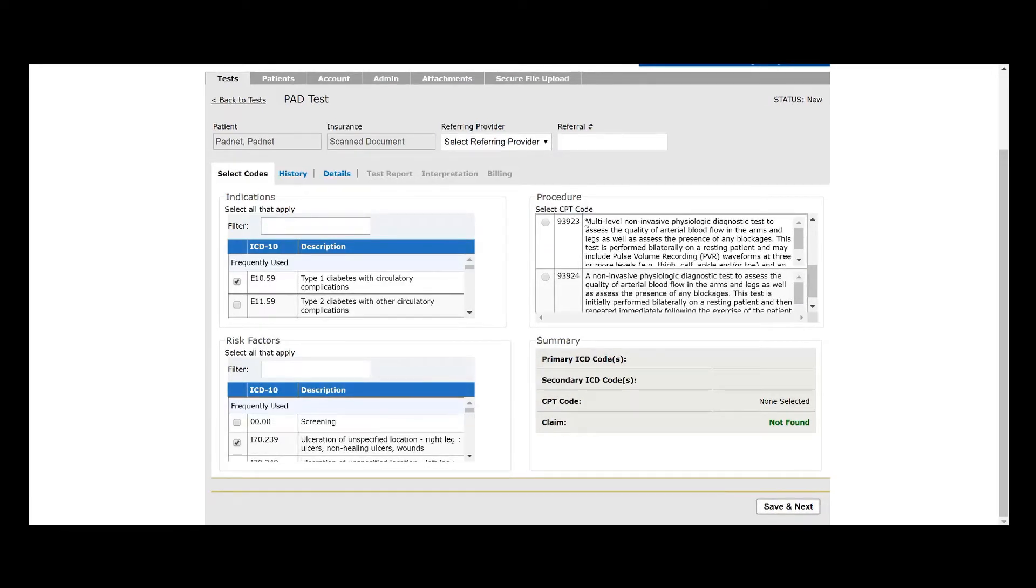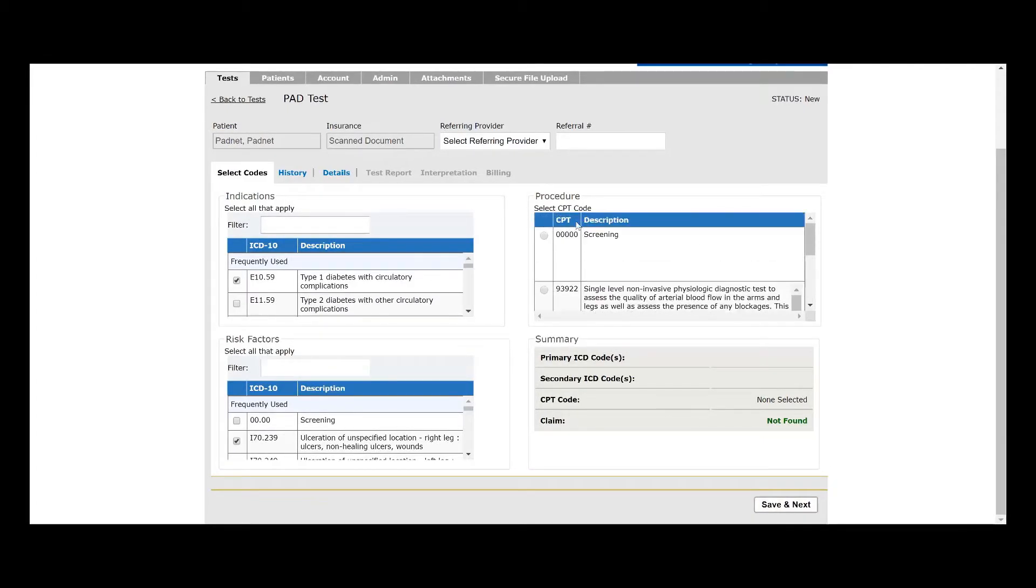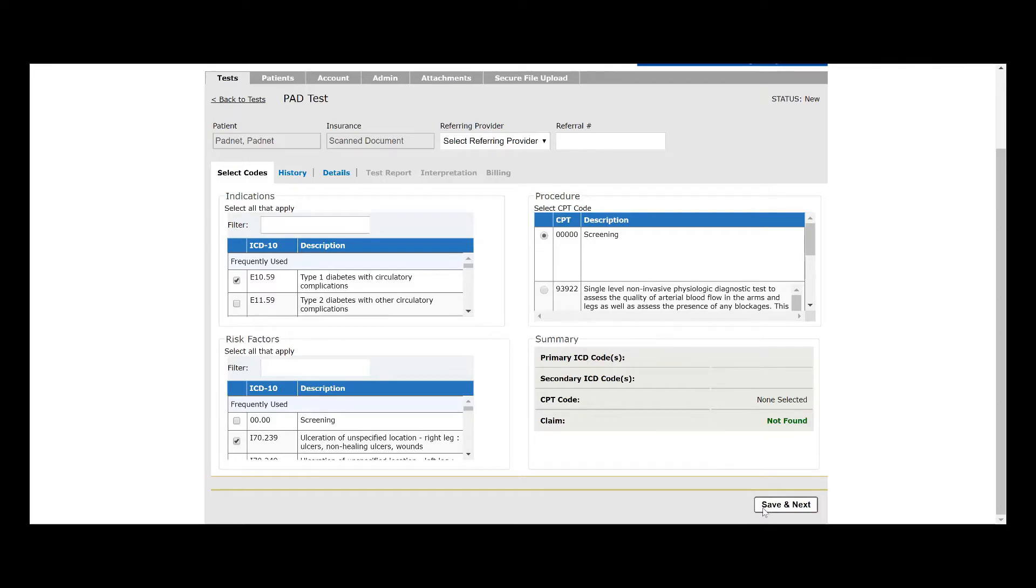If you're on our latest software, go ahead and select 93923, but if not, we're going to need to scroll up. Instead of selecting 93923, we'll go ahead and select Screening. This will allow us to submit and conduct a version of the test without including the ABIs. Don't worry, we'll still be able to bill it as a 93923. We'll just have to schedule it as a screening.